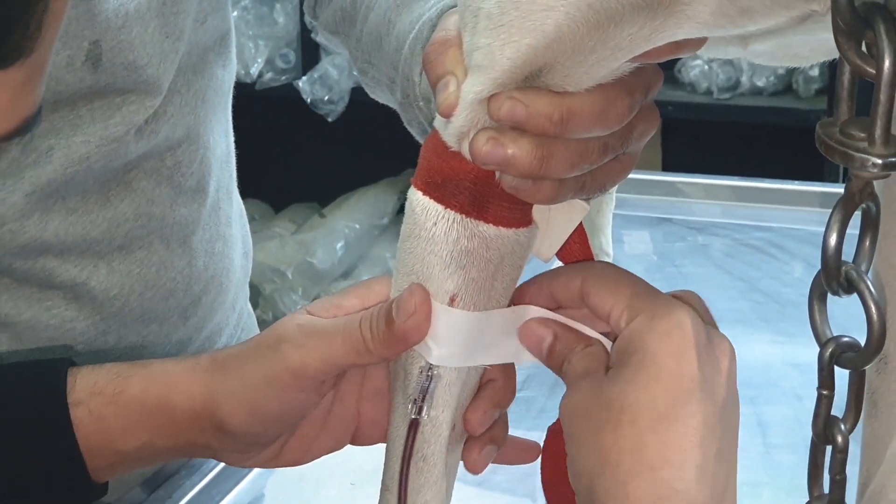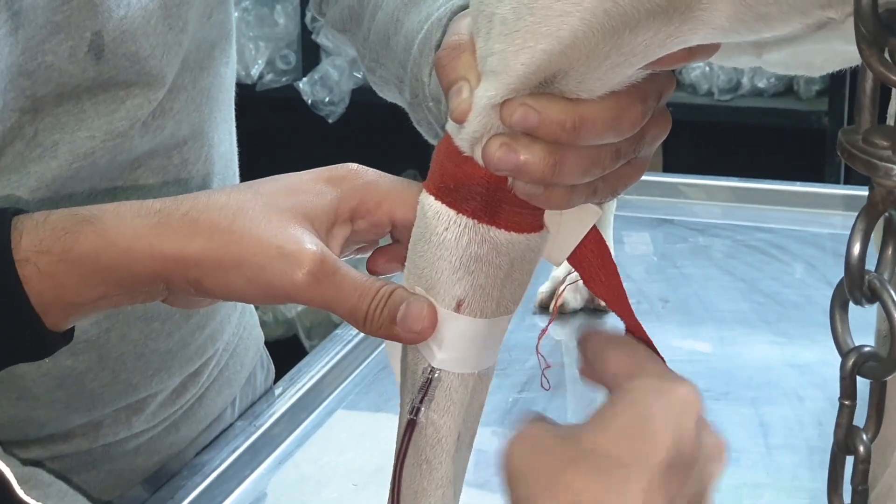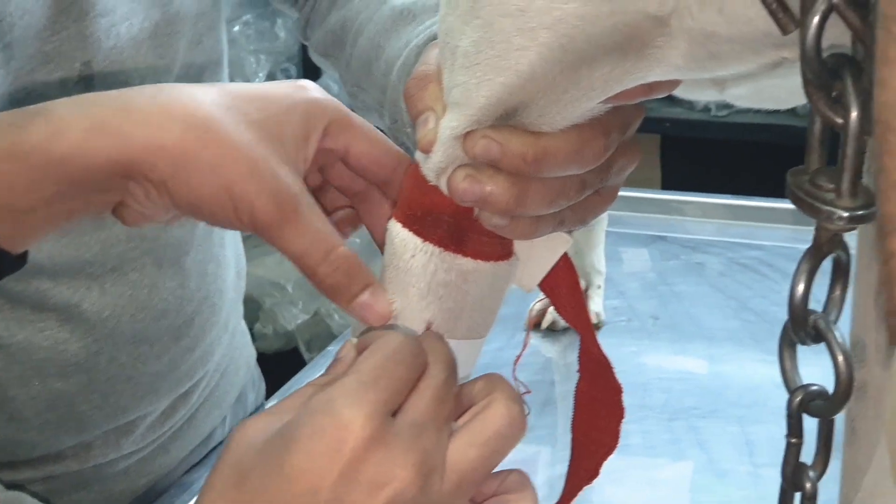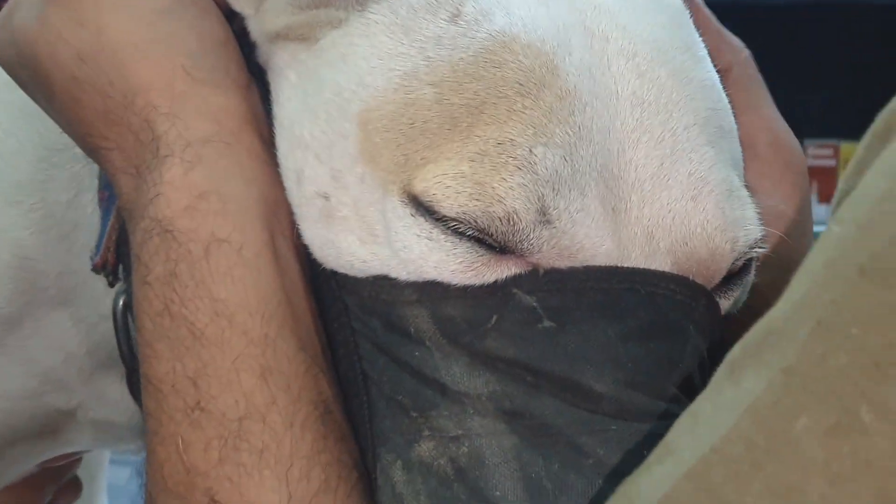You can see that we have placed the bag below the level of the dog so that the blood can easily be collected with the help of gravity. There are certain things we have to take care of — for example, that the donor animal has not been used for blood collection for the same animal previously.